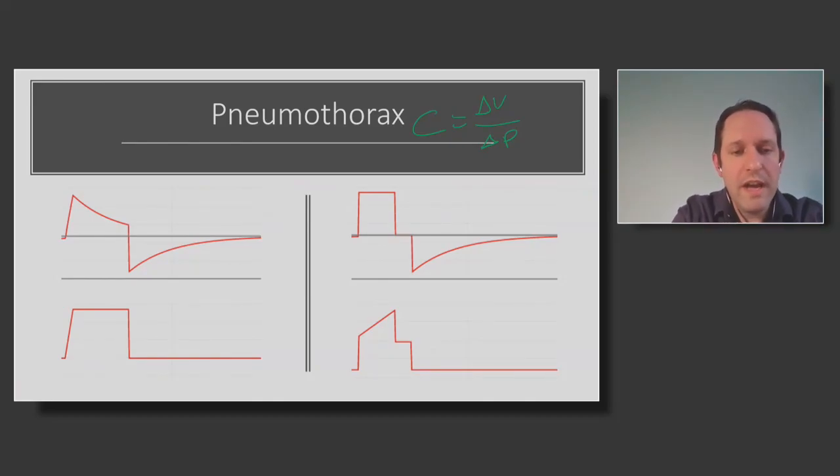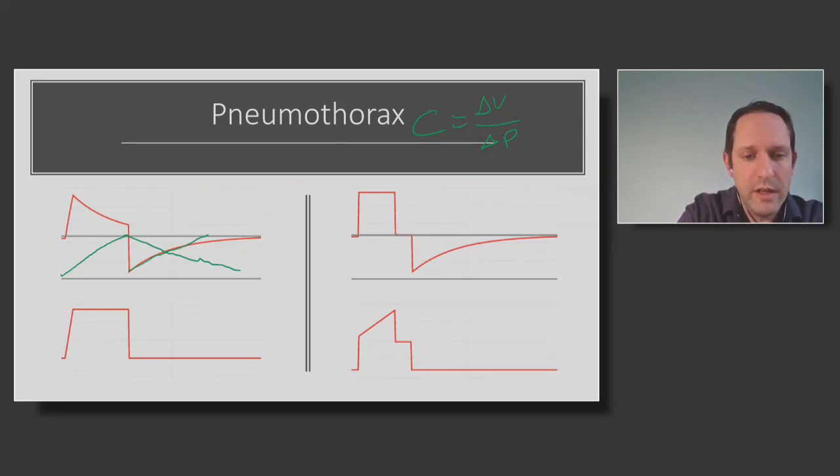Now, what will happen is that you will exhale the volume quickly, and the one graphic that I'm missing from this example, where it's most important, is the volume graphic. I'm going to draw it below the flow. So this would be what volume would look like. And then it will go down, and on the next breath you're going to get a drop like this, and then it's going to give the volume again.